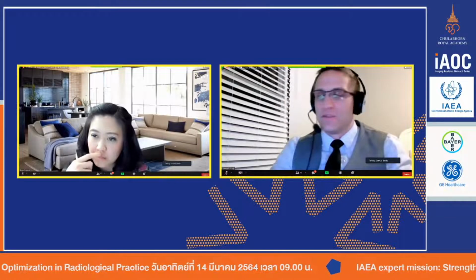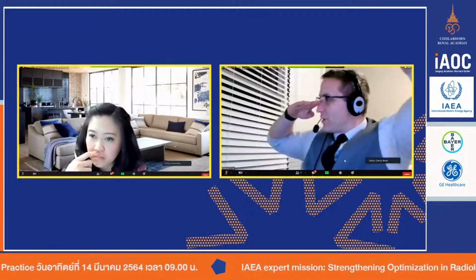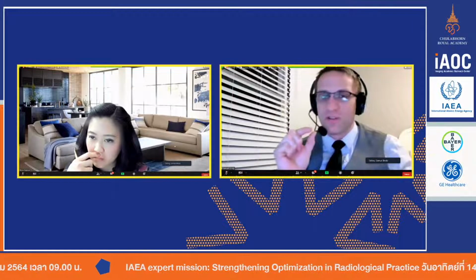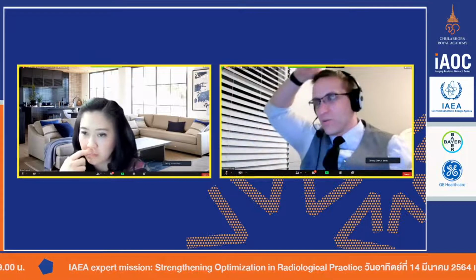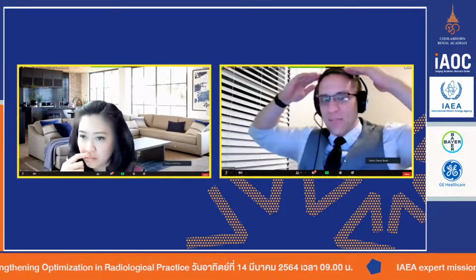Now, if you set your scan field of view like this, but you include a lot of air, set up here, it can have a small change because the system is going to see air here. And so it's going to have a really, really low MA. That auto MA is going to be really low here. And the minute it gets to the top of your cranium, it's going to need to ramp up. And it's hard for a CT scanner to go from a low number to a high number really fast. So there will always be a gradual ramping effect.